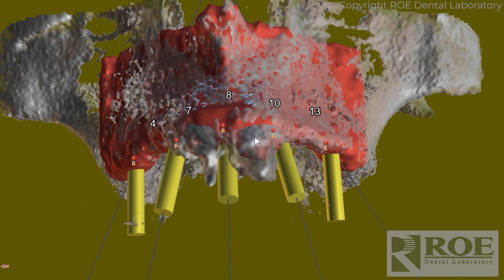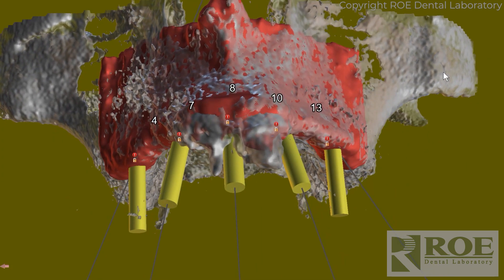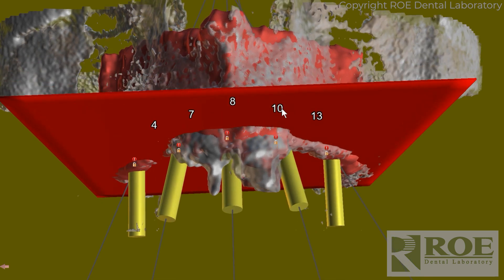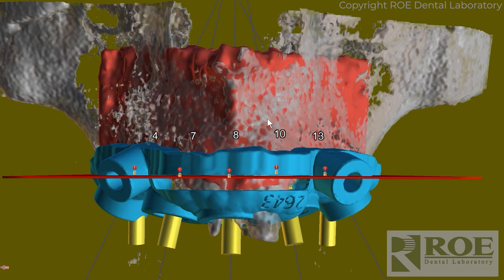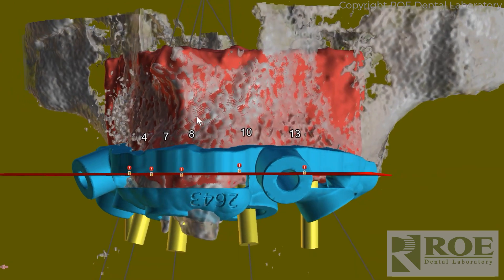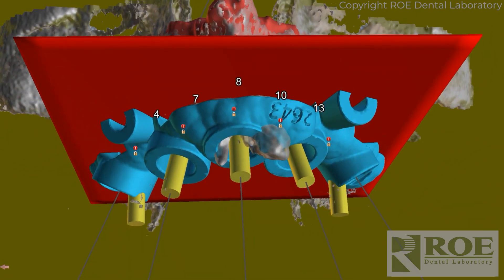We made a bone model so that we knew exactly how to make the guide. We planned the implants based on where teeth are going to be. We added a very simplified bone reduction plane and then we marked the bone channel guide based on the bone reduction. That's the process — that would be part of the whole planning meeting.